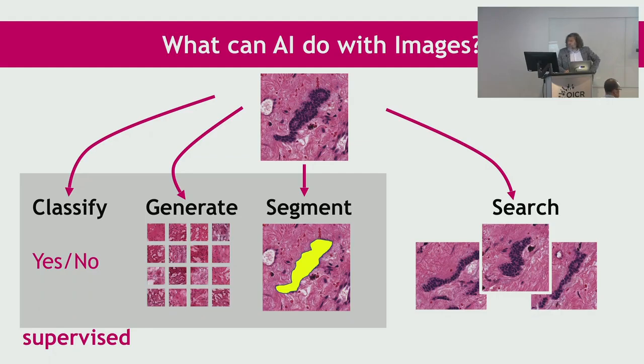And the supervised learning, again, the problem is that you need the pathologist to come and sit down with you, not one, multiple, and show you, draw in the image, delineate some regions of interest and say, this is malignant, this is not malignant, this is a cell nucleus, this is not a cell nucleus, and so on. Of course, this is not practical. We are doing it in a limited manner.